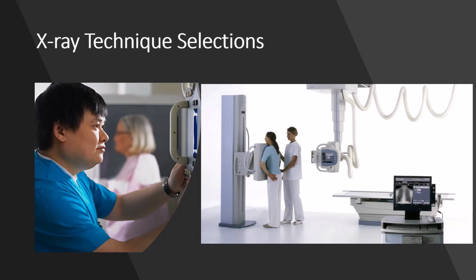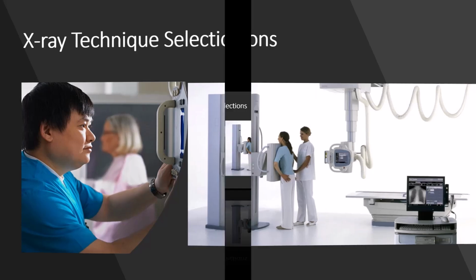Let's take a look at X-ray technique selections and how they impact your images. For exposure issues, anatomic programming and AEC work very well for the average patient, but do they work for all patients? We're going to review how manual techniques can actually reduce repeat rates and improve imaging on difficult patients.